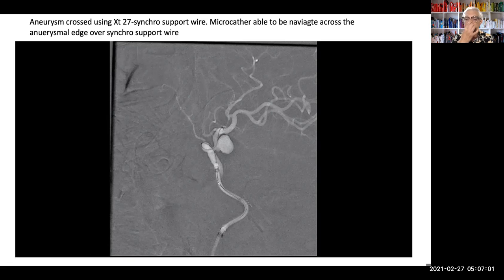But remember, it builds in tension. I talked about it before, how it induced a rupture in a patient when we went through a very tortuous segment in the ACA. So the important thing is to keep a close watch and do it slowly. You can see the wire moving, and here we have the wire reasonably distal.